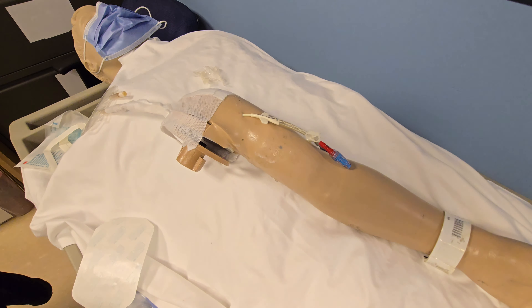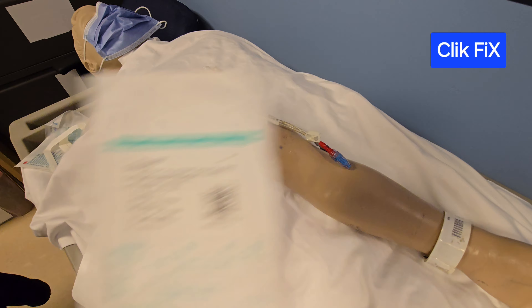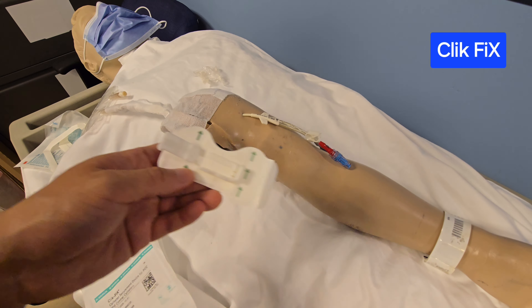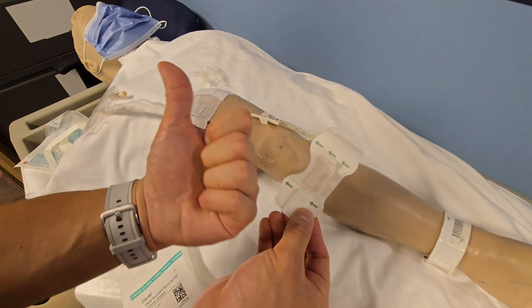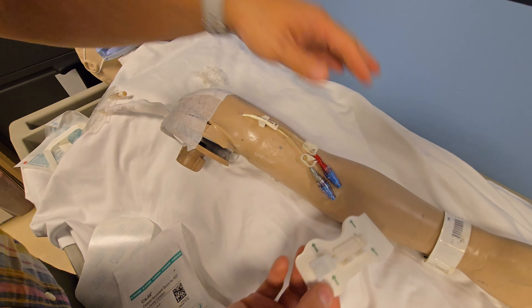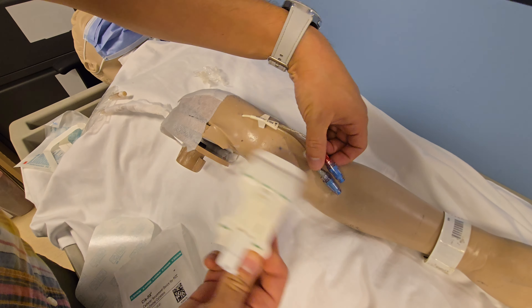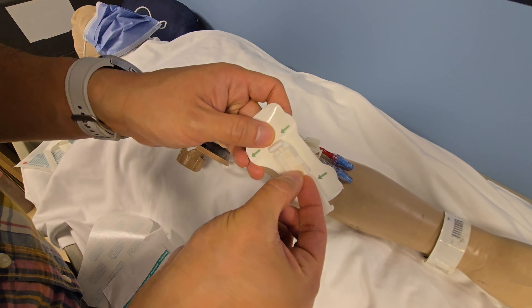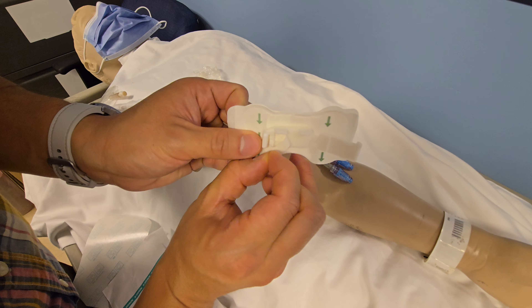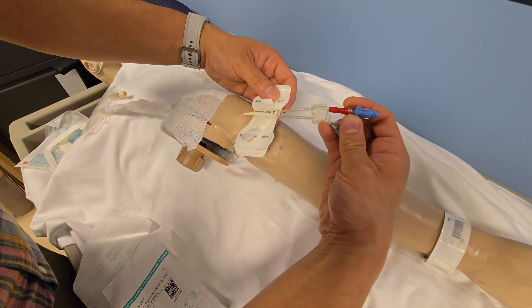The next device we're going to go over is called the ClickFix, from the company called Bard. The packaging looks like this. You're going to see that this one also has arrows — the arrows always point towards the heart, because that's where the PICC line goes. Once we have cleaned our site with chlorhexidine and removed the previous dressing, you'll notice this one has a little piece of paper covering the adhesive underneath. We remove the adhesive backing, put the line in, and it sits right here.